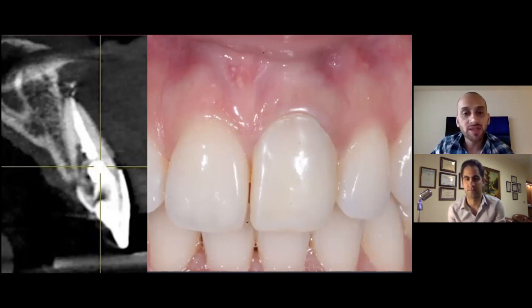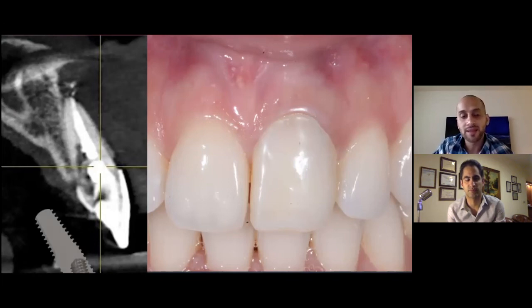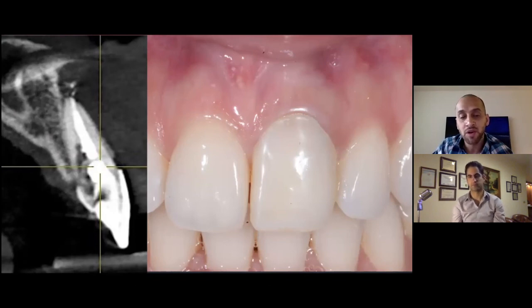Okay, so this is a case that I'm not going to get into so much surgery, but again, you can see that there were some problems associated with this case. The apex has some gutta-percha protrusion through the apex. However, the most important thing to realize about this case is that there is a little bit of buccal bone that's still attached. One of the most important things that we must be careful here is not to open a flap. We must try to do this flapless surgery.